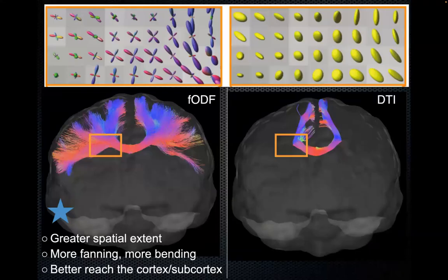So a recommendation, of course, this is a star. I mentioned this earlier, but if you have DTI only, you just have the curve, like the mohawk. And suddenly with crossing fibers, you get the whole motor homunculus. You can traverse the traffic jams. But as we're going to see after the break, it's also easier to get lost.